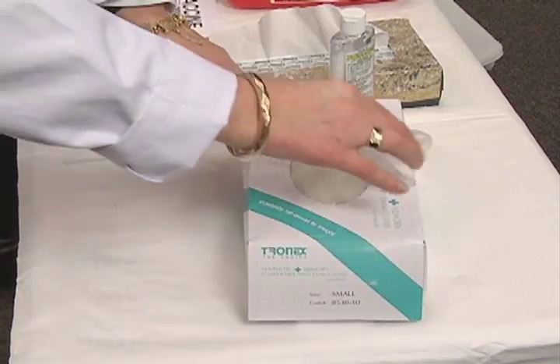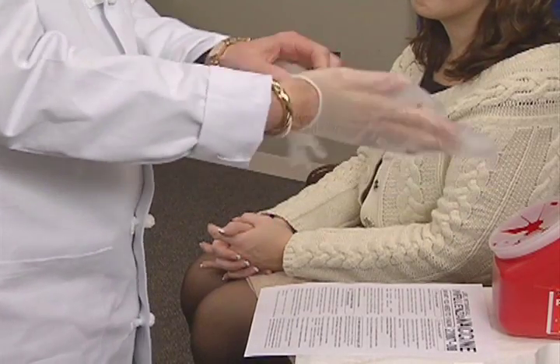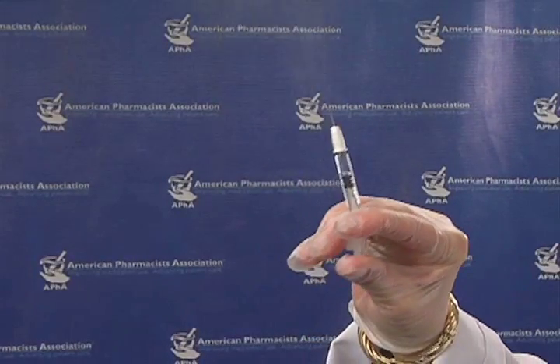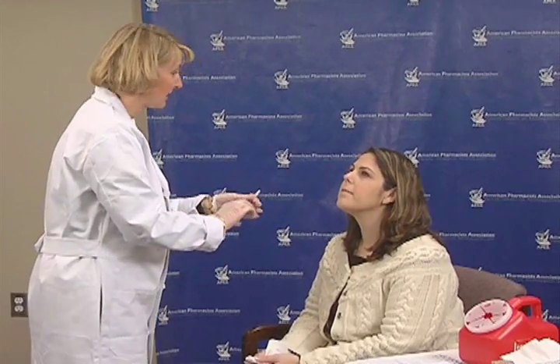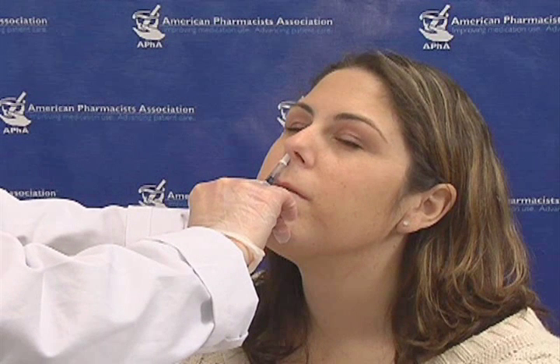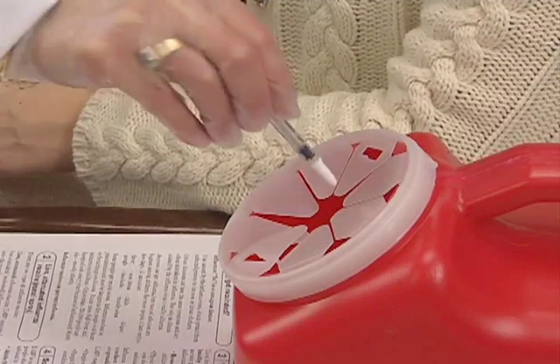Be sure your patient is sitting. Hand the patient a tissue in the event there is post-vaccine nasal discharge or sneezing. Although gloves are not required, it may be prudent to use them — follow your local standards. Remove the rubber tip protector; some degree of force is needed to deliver the intranasal vaccine. The patient should be in an upright position with the head tilted back slightly. Place the tip inside one nostril and, with a single motion, depress the plunger as rapidly as possible until the dose divider clip prevents further movement. Remove the tip from the patient's nose, remove the dose divider clip, and administer the remaining dose into the other nostril. Discard the syringe in a biohazard container.